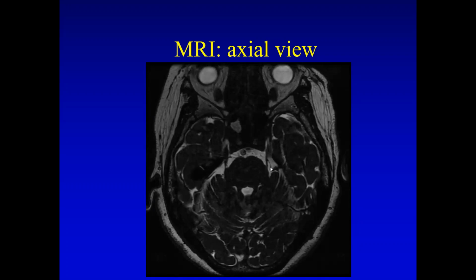In this case, on the left, here's the blood vessel curving into the nerve. And on the right, there's a blood vessel perpendicular to the trigeminal nerve. So you can see clearly on these scans both the nerve as well as the blood vessels pushing on the nerve. This is why these specialized sequences are very important, because they give us a lot of insight into what is going on around the trigeminal nerve.